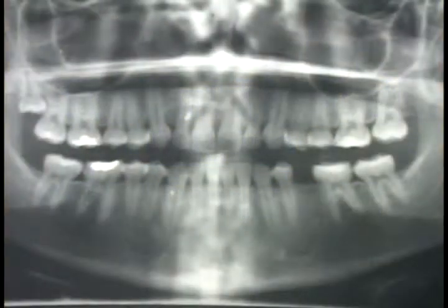This case shows a missing lower right second bicuspid. The distance between the adjacent teeth is approximately 10 millimeters, and the distance from the crest of the ridge to the superior aspect of the mandibular canal is approximately 14 millimeters. The recommended distance between the side of an implant and the periodontal ligament of the adjacent tooth is approximately 3 millimeters. Therefore, a 4.1 diameter Endopore implant would allow for 3 millimeters of bone between the implant and the adjacent teeth.